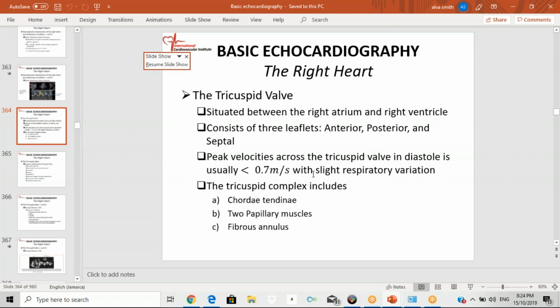because what they will do is give you both, or they'll give you a systolic envelope, and show you it will be varying with respiration. You get small ones, a little bit larger, small ones. When you have mitral regurgitation, you're not going to get that type of variation. Anything that occurs on the left side of the heart doesn't usually give you that type of variation.